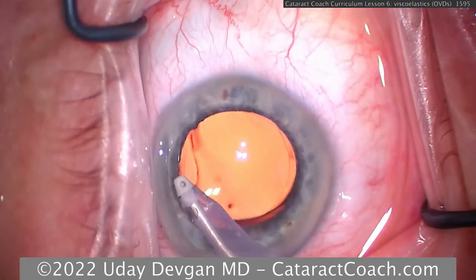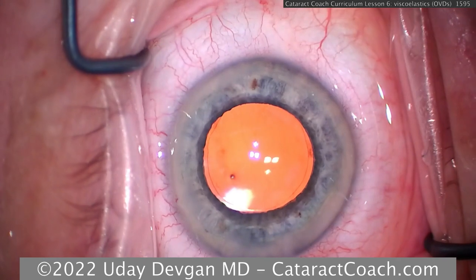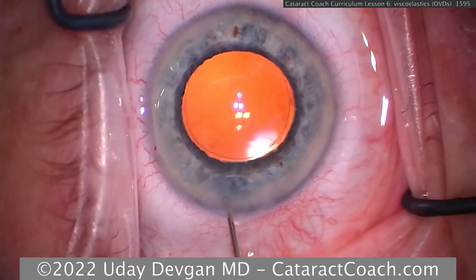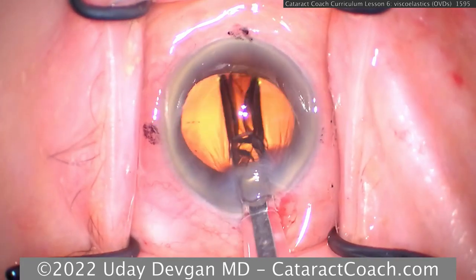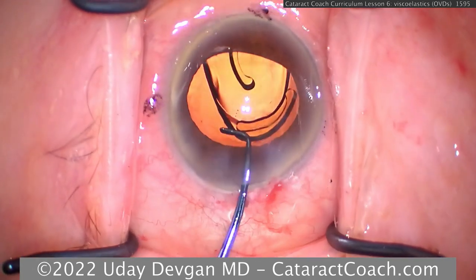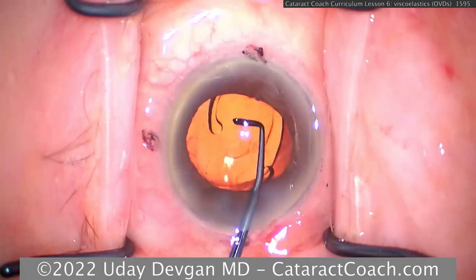And that looks great. So the question is, do you have to do it? And it depends on the case. If you're a new surgeon who's starting off, you've done less than 100 cataracts, it's perfectly acceptable to not do that, to just tilt or rock the optic back and forth and try to express as much viscoelastic as you can that way. But as you get better and better and more confident with your intraocular skills, it does become important to remove that viscoelastic.